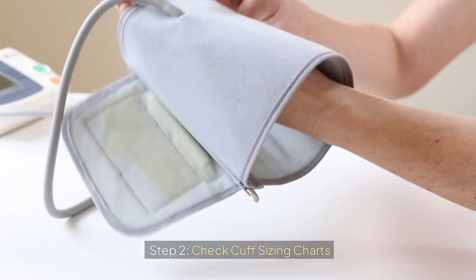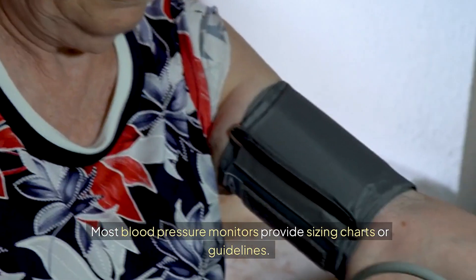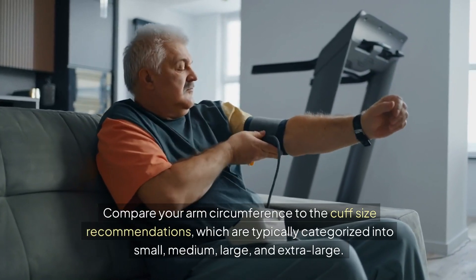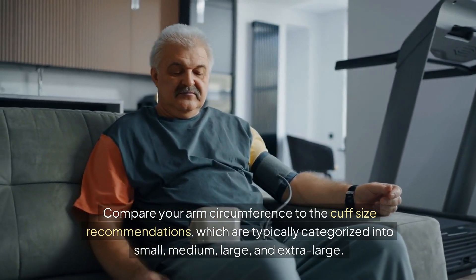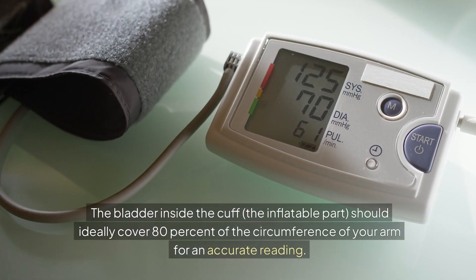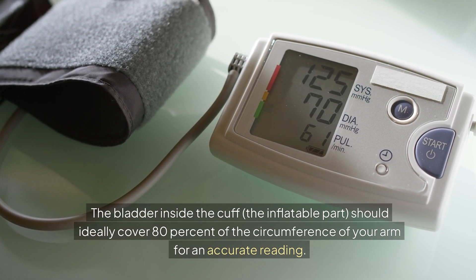Step 2: Check cuff sizing charts. Most blood pressure monitors provide sizing charts or guidelines. Compare your arm circumference to the cuff size recommendations, which are typically categorized into small, medium, large, and extra large. The bladder inside the cuff — the inflatable part — should ideally cover 80% of the circumference of your arm for an accurate reading.